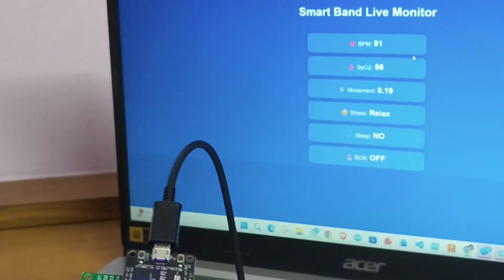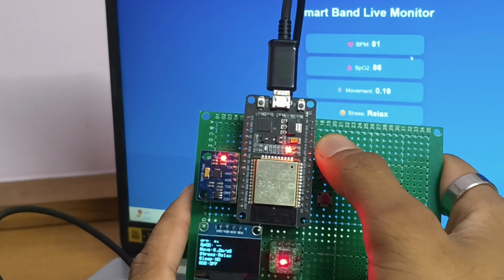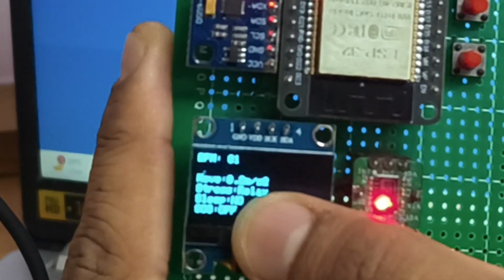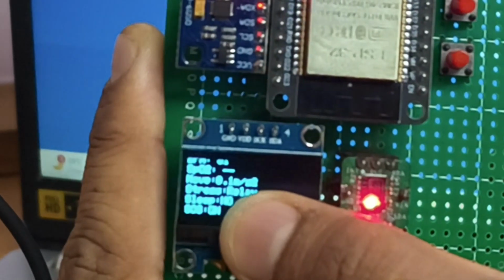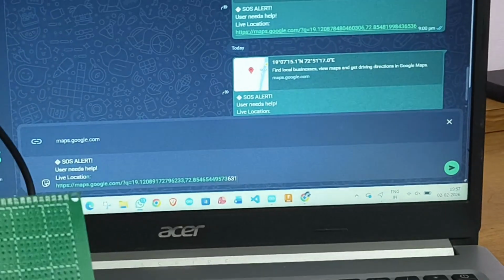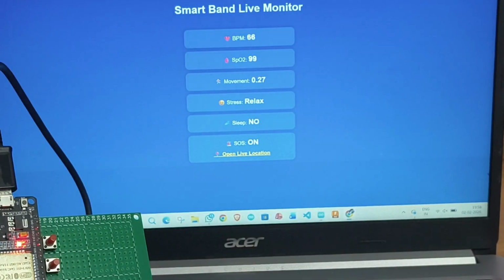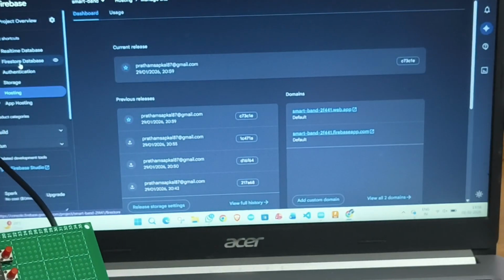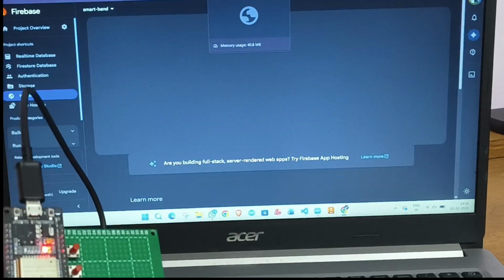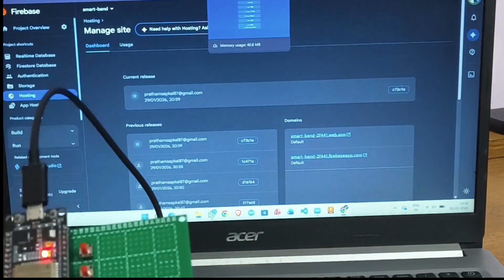Now the main part of this is to send a message. So when I click this button, an SOS alert will be sent. The website is still here, and also the data is stored in Firebase Firestore with the location. And this is my full project for the smart band.